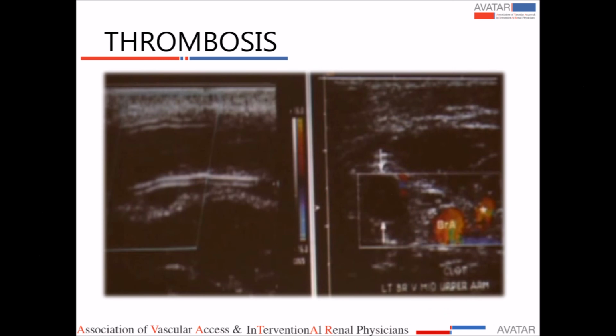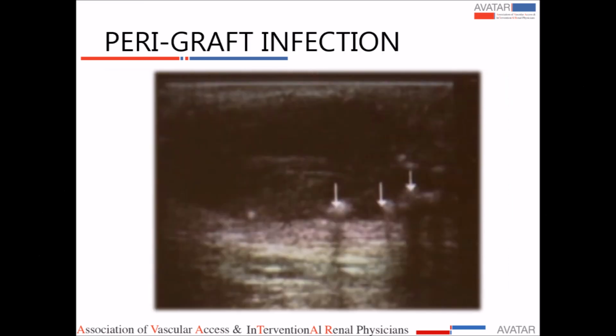Where you use the color Doppler or even the power Doppler is where you see the access. I mean, obviously, auscultation is very simple, very easy, but sometimes it gets confusing. Do the Doppler ultrasound, and there's absolutely no flow through the access. And you can use the ultrasound if the patient has swelling post-operatively. Sometimes it's infection, and sometimes it's just normal post-operative swelling. You can use the ultrasound in this particular patient.